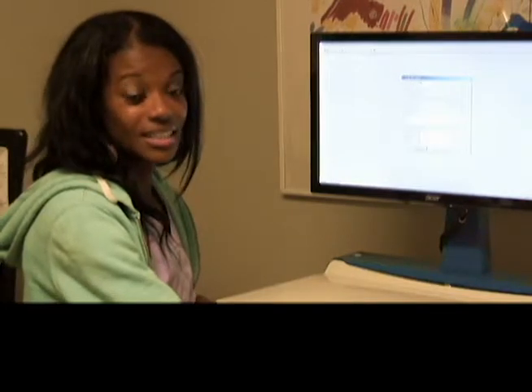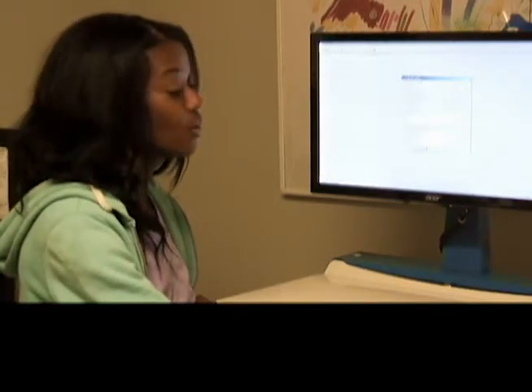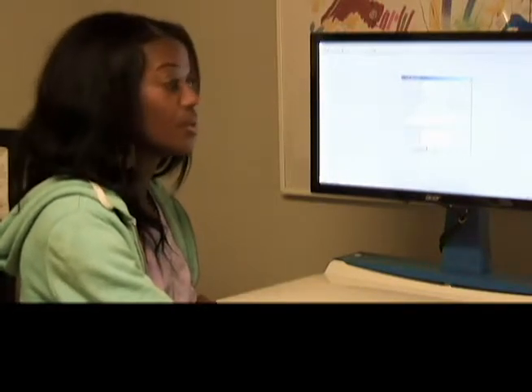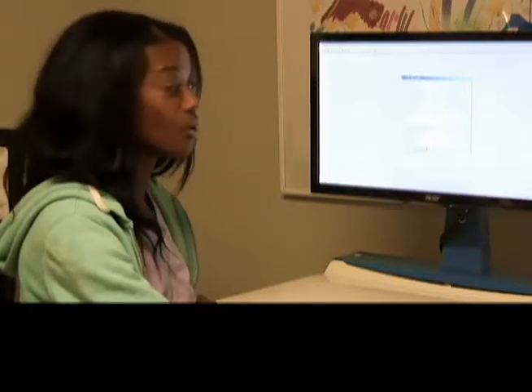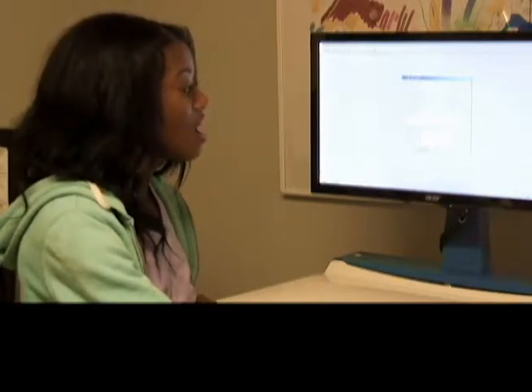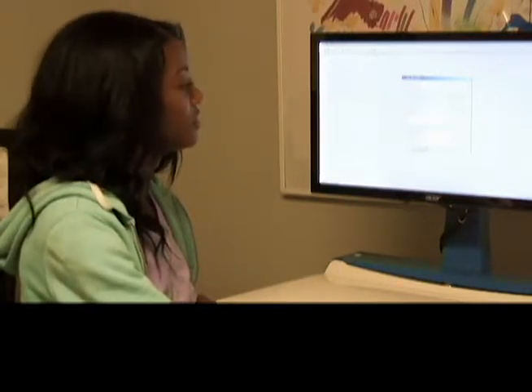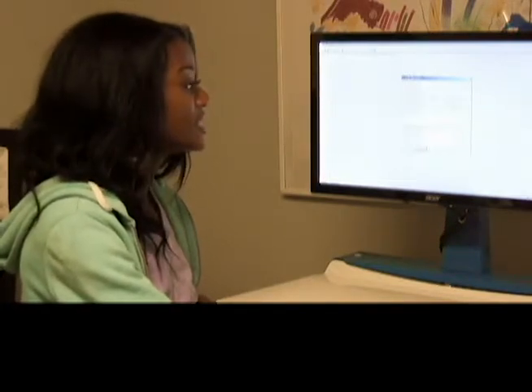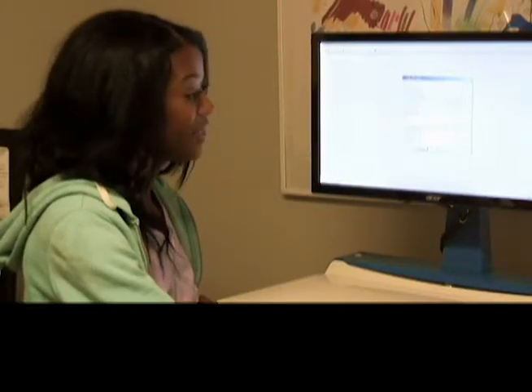So the next screen is a pre-study screen, and it's basically a way to select the reason that the patient is here and what their diagnosis is. You can check vomiting, nausea, gastroparesis. You can add any additional notes that you'd like to add for the doctor. Also, you're going to add the attending physician, the referring physician, and the tech. And then you're just going to hit begin study.